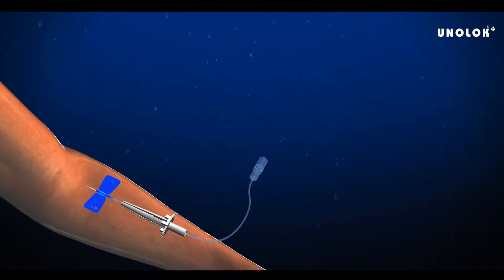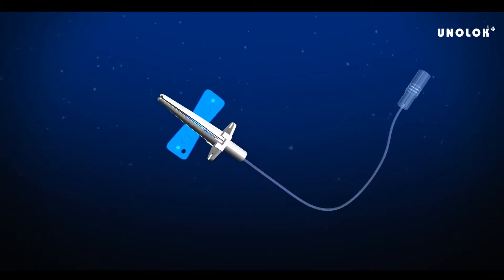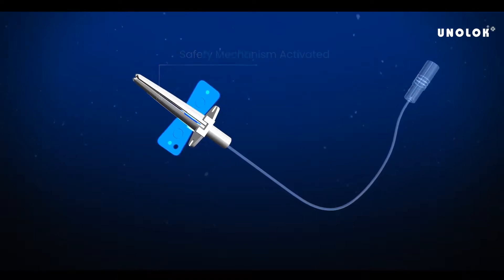Slide the safety guard up to the back of the wings before removing the needle from the patient. After pulling the needle from the patient, the safety guard can be slid up over the wings while holding the PVC tube stationary.